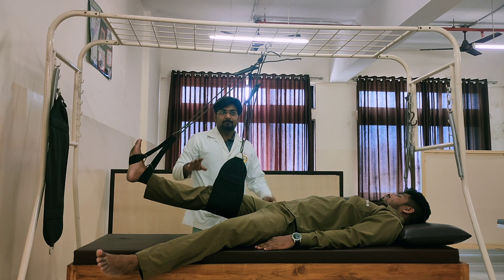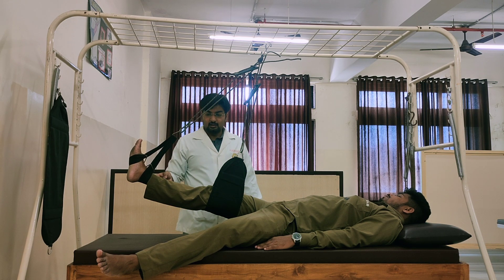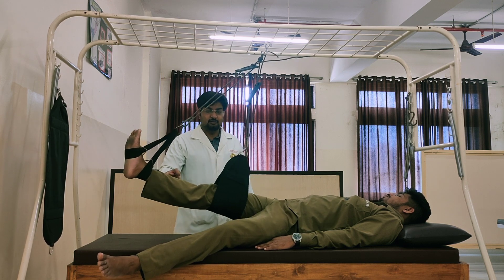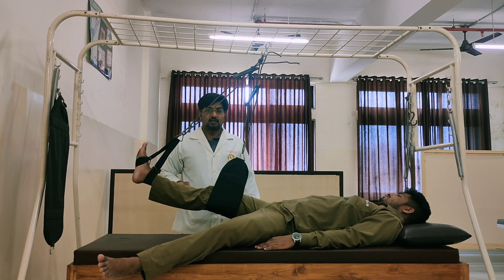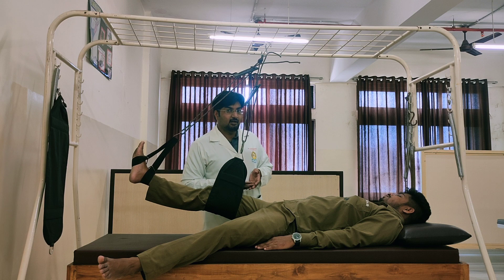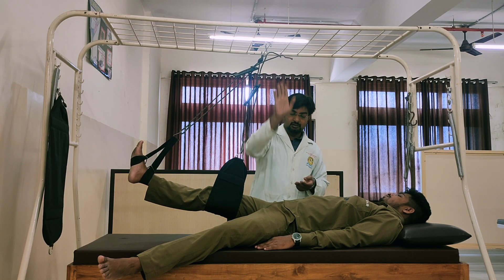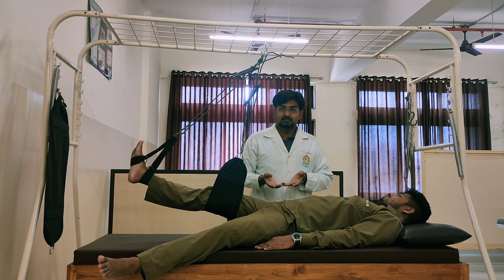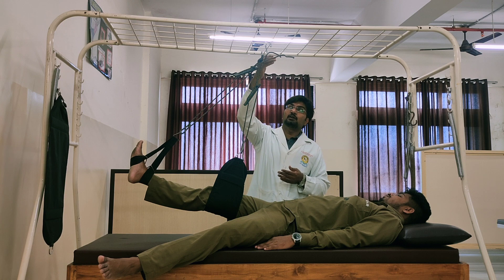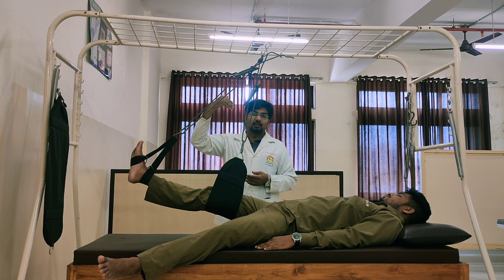Now you can see that the tension on the rope is proper and the movement of the hip joint can be done properly. So this is the abduction and adduction. Whenever you want to assist the adduction, just shift the point medial to the hip joint — it will assist. Whenever you want to assist the hip joint muscles, you have to shift the point of suspension toward the lateral side of the hip joint.